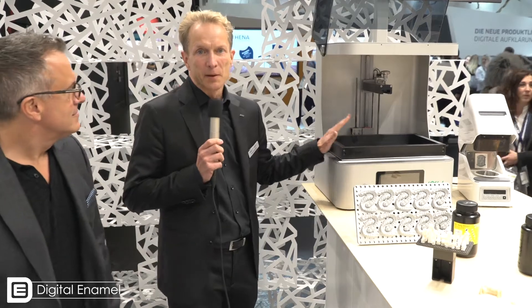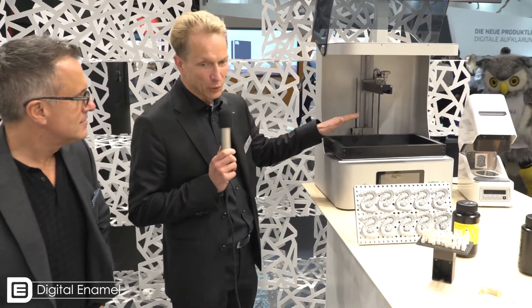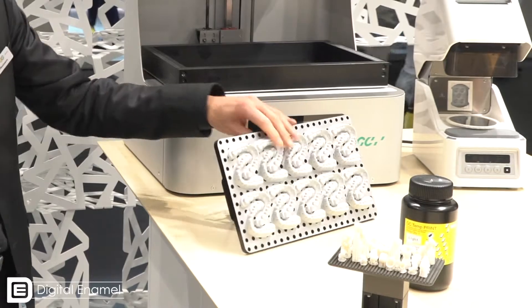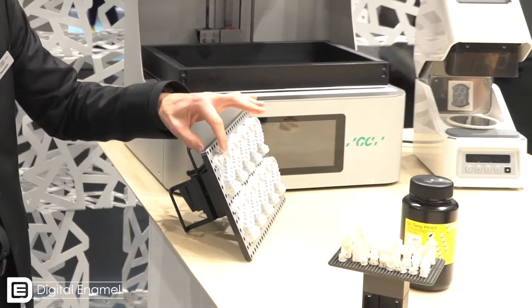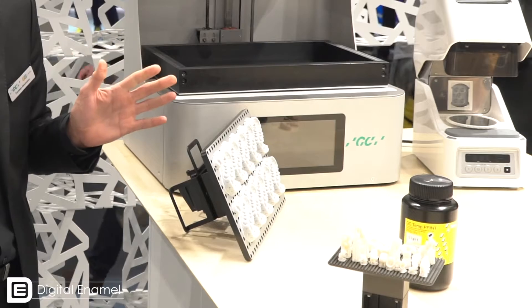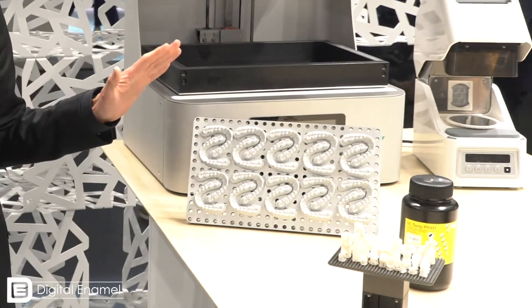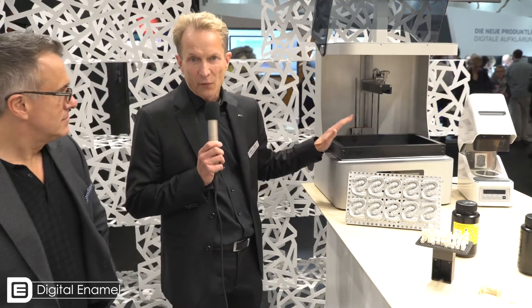Torsten, tell me a little bit about this printer. Yes, of course — this is one of the first devices in the world which uses an LCD screen for printing crowns, bridges, and whatever you like. We've got a really huge build plate for printing, and you can print this height of models within 40 minutes only. 40 minutes — this is really amazing, it's an incredible speed.